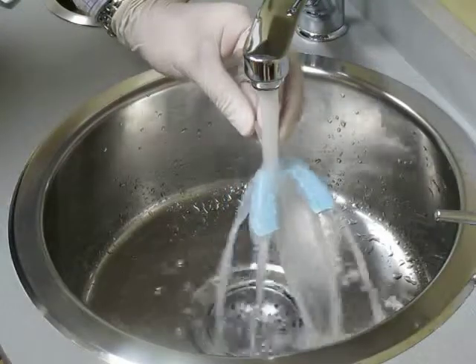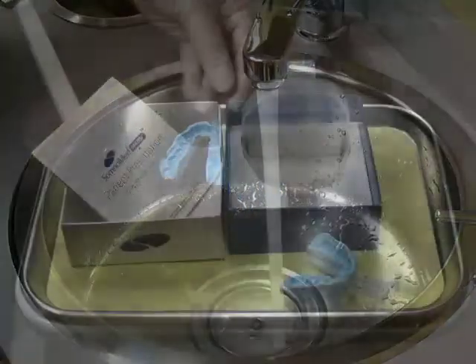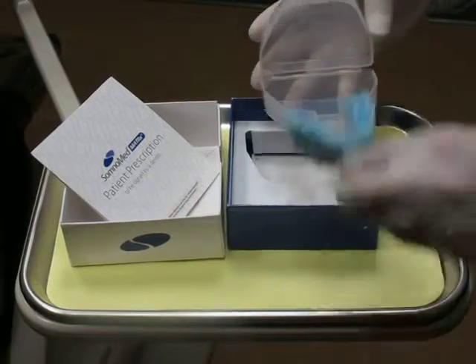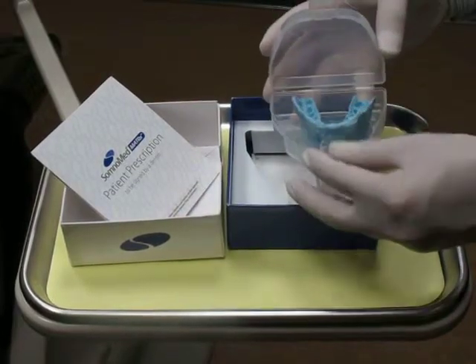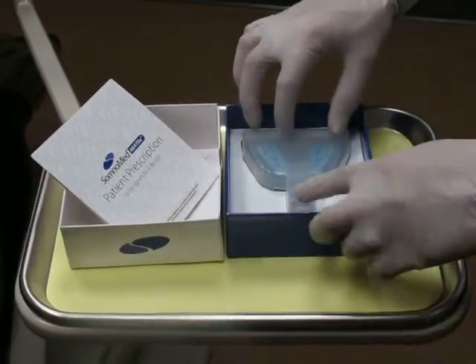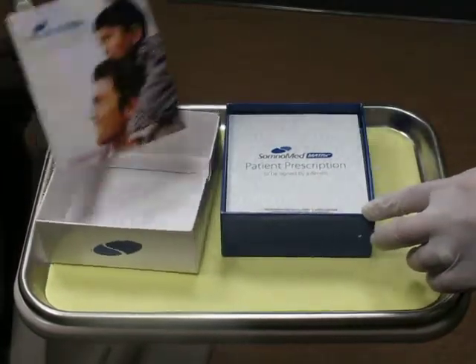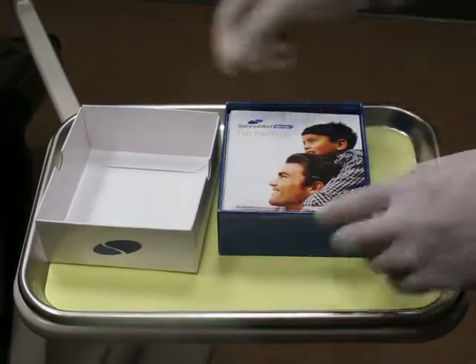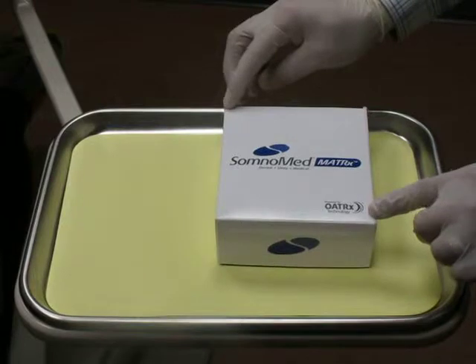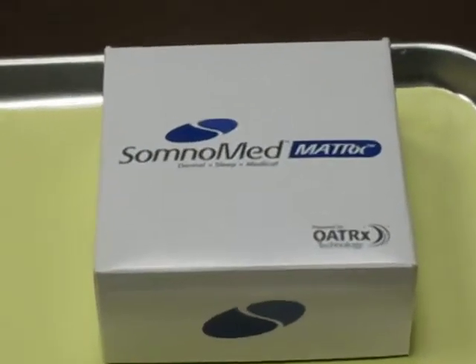To prepare the patient's trays for transport to the sleep lab, rinse each tray under cold tap water for 30 seconds. Once clean, dry the trays and then place them in the tray case. Place the tray case in the titration tray box along with the patient prescription card and the patient information brochure. Your patient is now ready to proceed to your local sleep lab for an attended MATRx titration study.